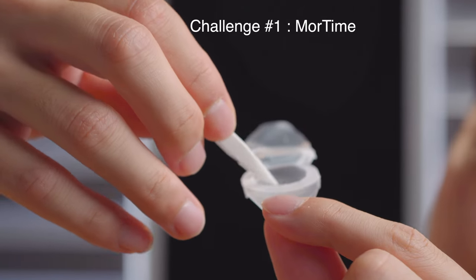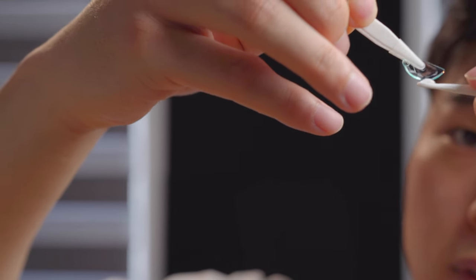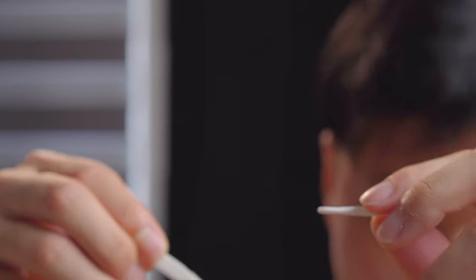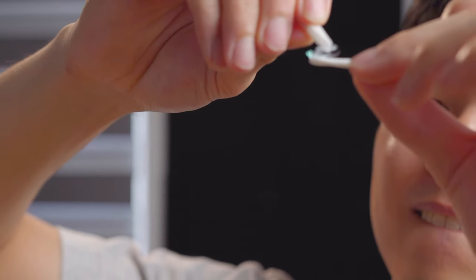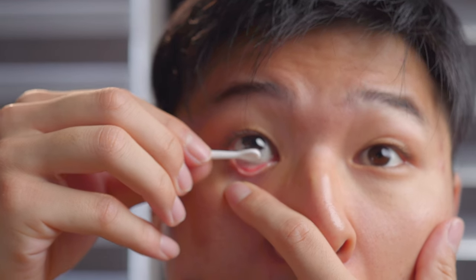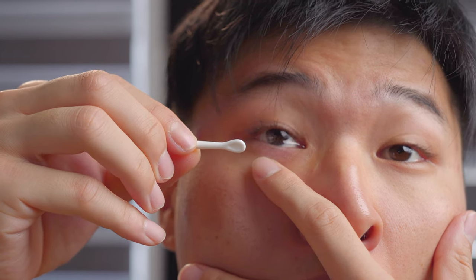I'm going to take the lens out of the solution and bring it onto the applicator. I'm going to have to use a new lens now. All right, let's try that again. I'm not sure if that's in — I think that is. Okay, so the application wasn't that bad.